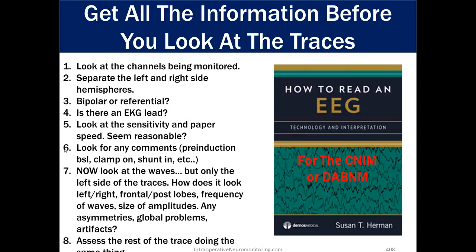You want to look for any comments or anything that's posted on that picture. Every once in a while, you'll see a straight line drawn through it, and it'll say clamp time or clamp here. They're hinting at what you should be looking at before and after. So look for those different comments that are made on the picture itself.